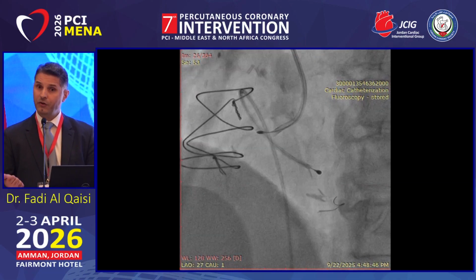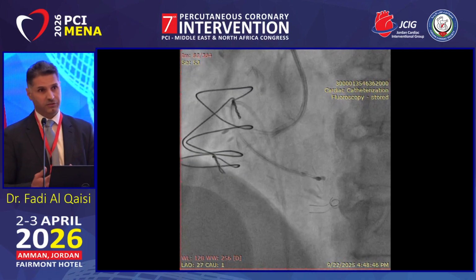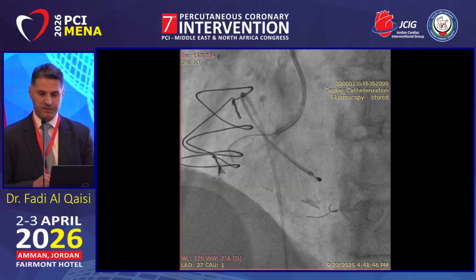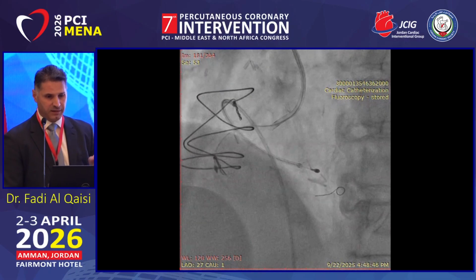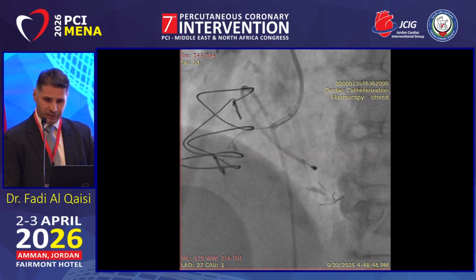So I told the patient, are you ready for the next one? Don't forget the cost of the Rota. So he said, yes, I'm ready to. I said, okay, let's move on. So I moved to the RCA. I started to Rota. The RCA I did with a pacemaker. And there was some difficulty with concerns about the perforation, but it went smooth.